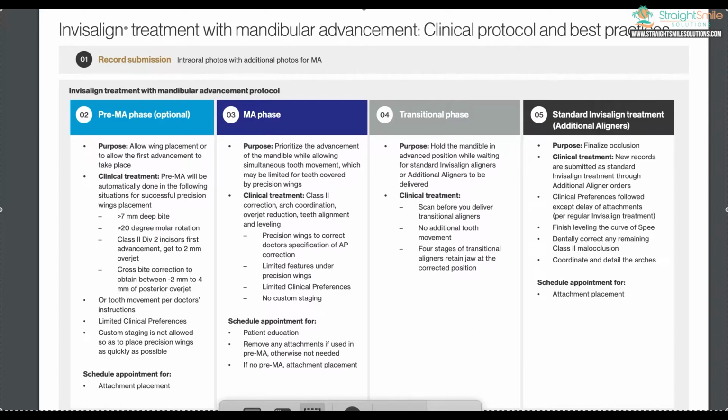I know they discount the Invisalign Second by a teeny tiny bit, but ultimately with retainers, you're almost at $3,000 on lab fees unless you have volume discounts. And that is just way too much for plastic as far as I'm concerned. So for that reason, I don't love Invisalign First, but it's an option, right?